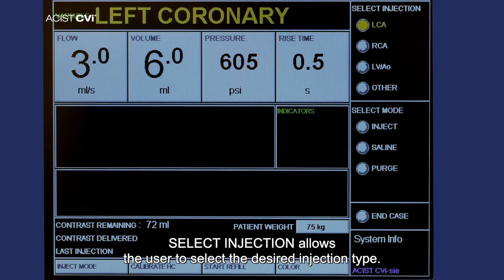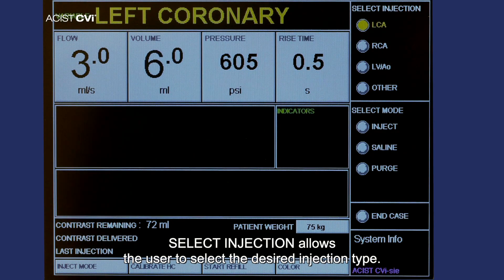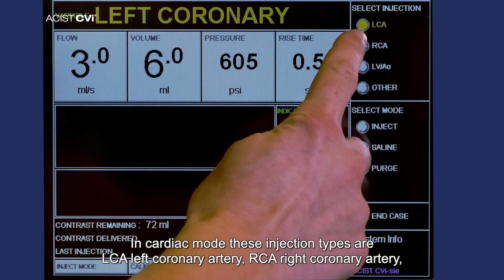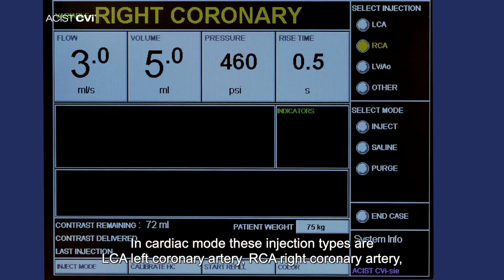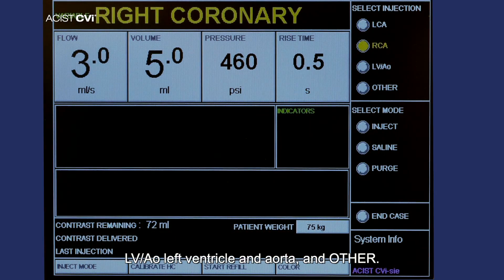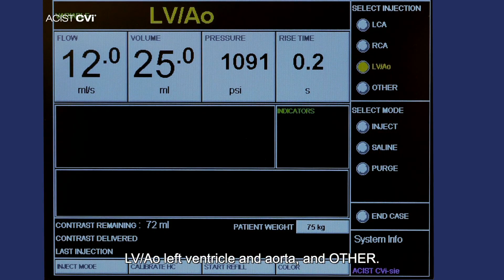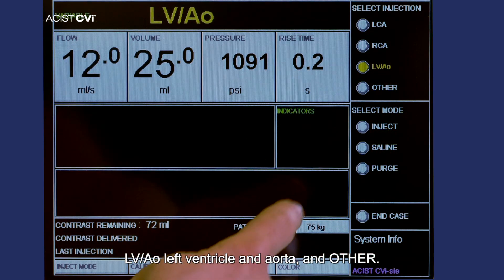Select injection: allows the user to select the desired injection type. In cardiac mode, these injection types are LCA (left coronary artery), RCA (right coronary artery), LV-AO (left ventricle and aorta), and other.